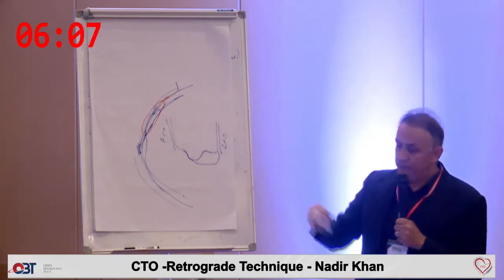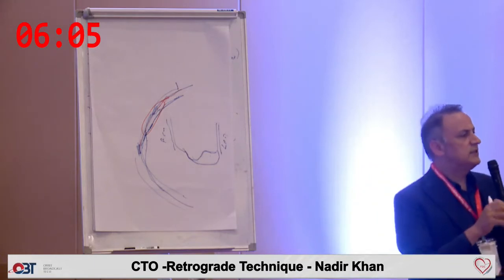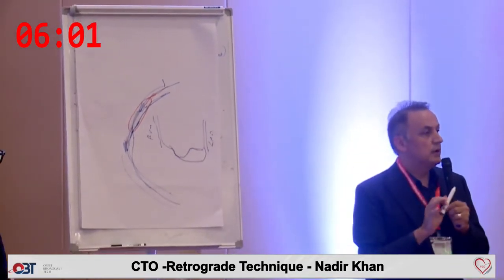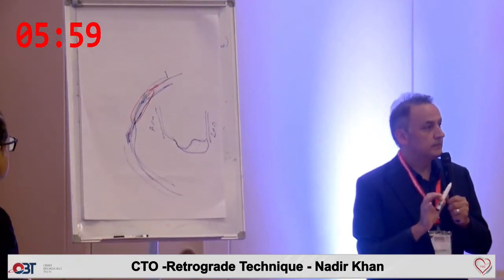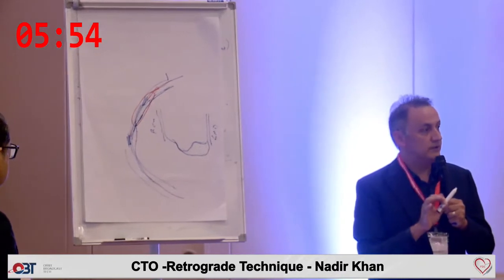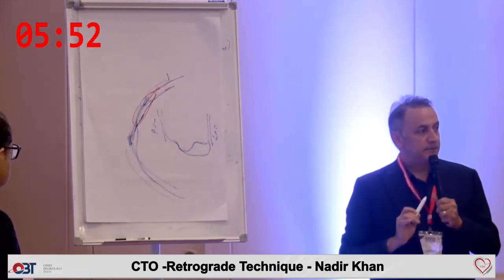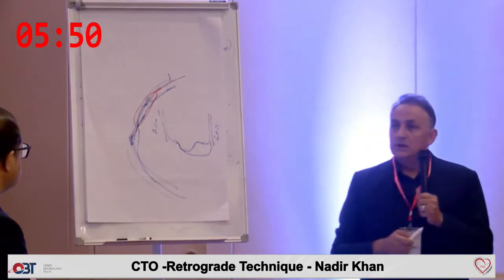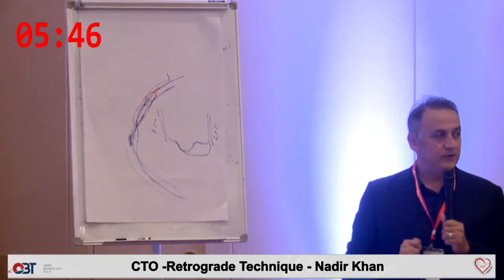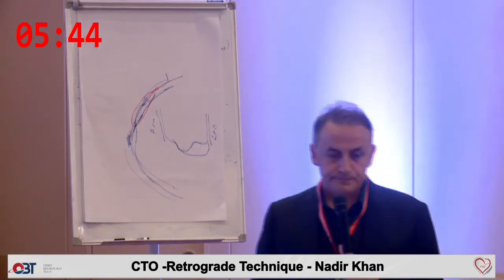And if it's really difficult to push it, especially from this area, you had better do ballooning, dilatation. You can't dilate epicardial collateral, but you can dilate septals. That's what I want to say. But this is a difficult scenario, to be honest. Slide.